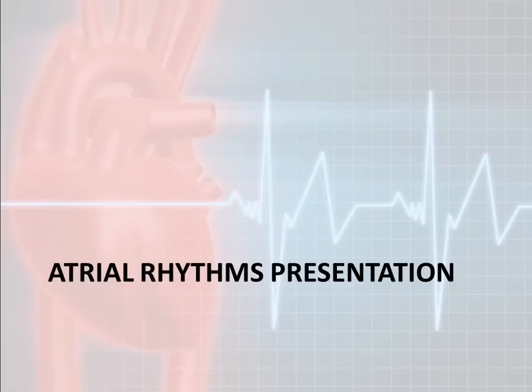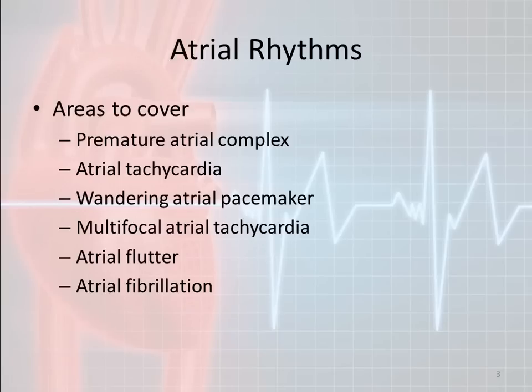In this presentation, we're going to discuss several of the atrial rhythms and some of the atrial issues. The different rhythms we're going to cover today are the premature atrial complex. As you notice, it says complex. In the past, they used to say contraction.